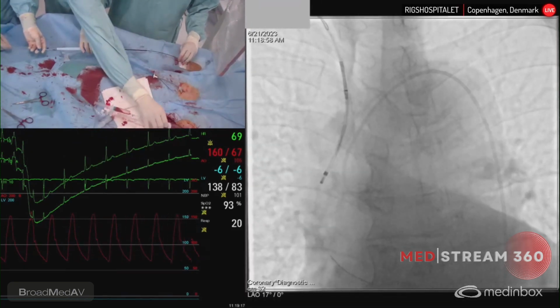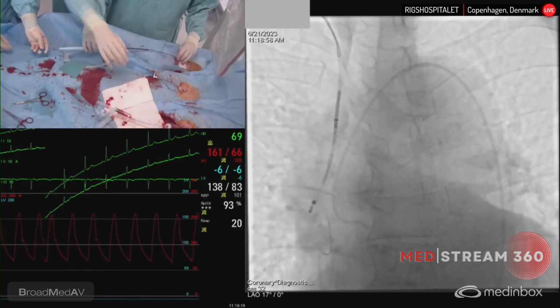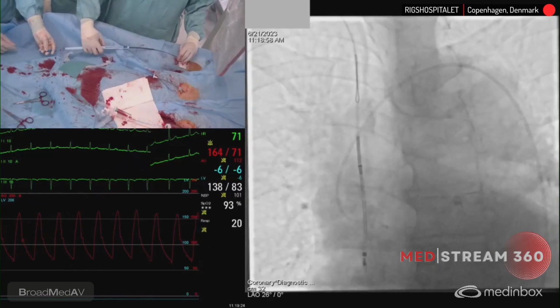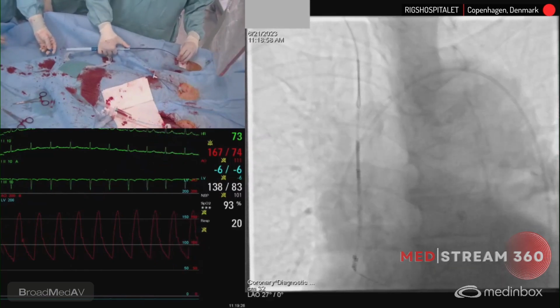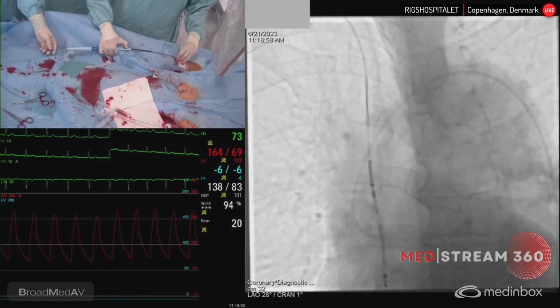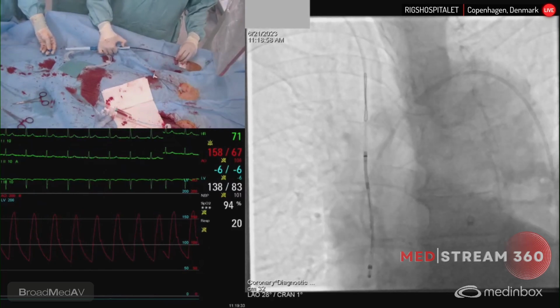Maybe because I saw it on the CT, these vessels are pretty close to the valve. They're not really on top of the arch. I'll open up the arch more even. I think maybe a tiny bit lower, and then you're almost in a good position to deploy the first filter. Yeah. Okay, you can go ahead.